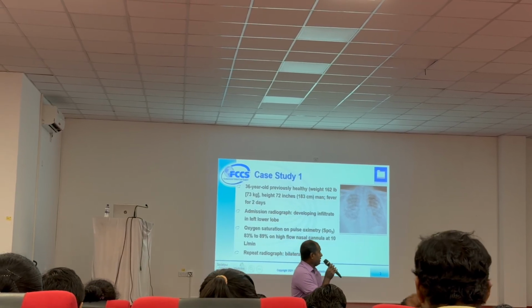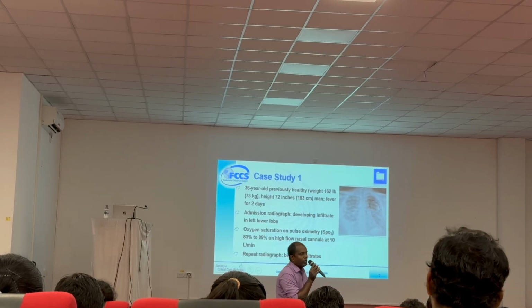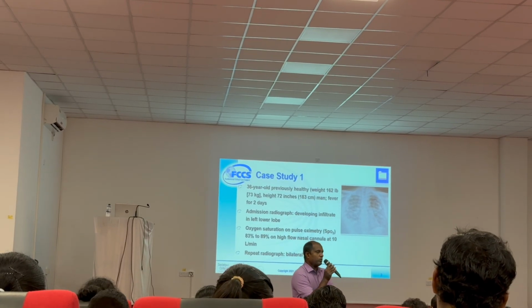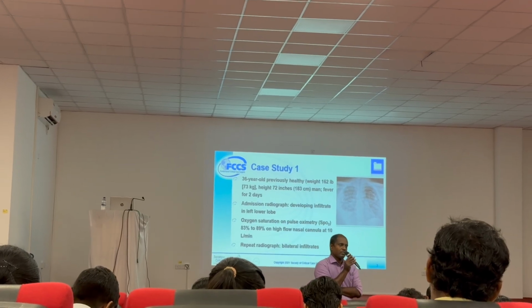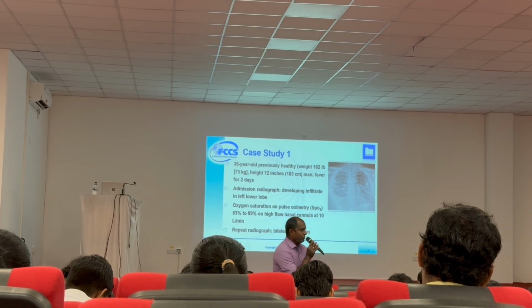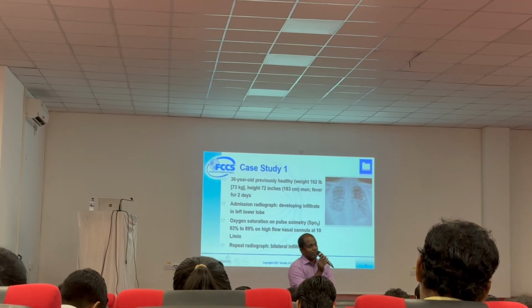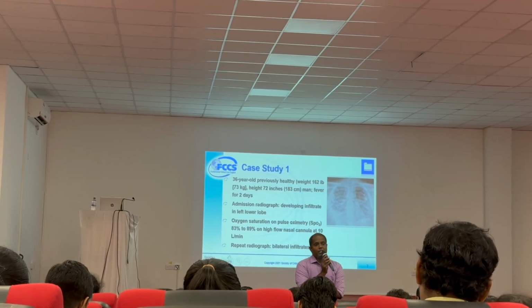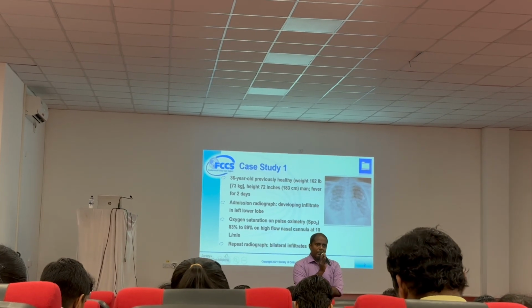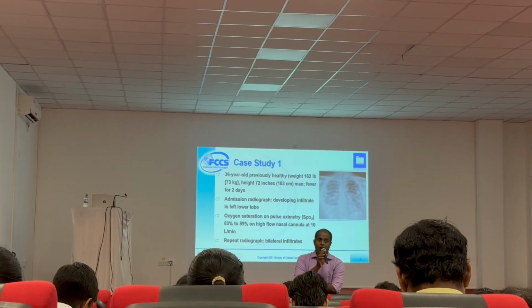No. These FCCS slides always talk about volume, because in the US they always put the patient on volume control ventilation. That's why these case scenarios are built around volume control. We usually don't prescribe volume control, but that doesn't matter because both are the same in the end. Now you clearly know why we need to prescribe the ventilation by ideal body weight.